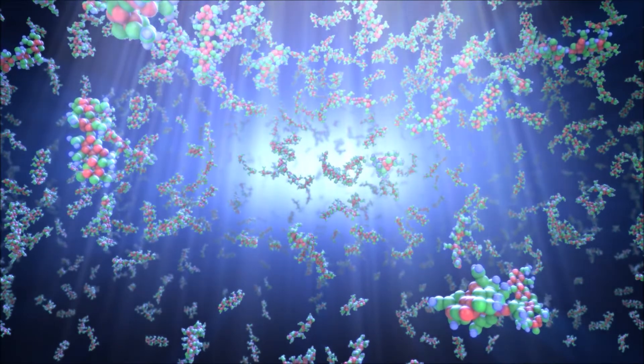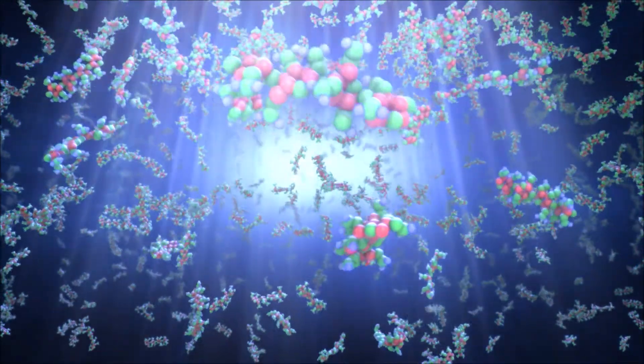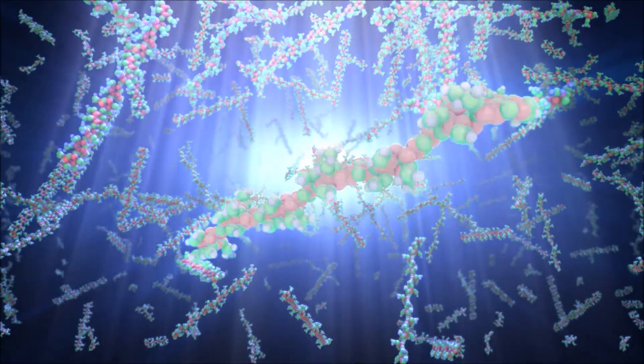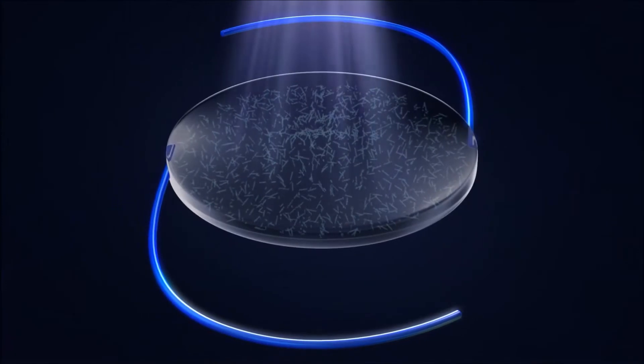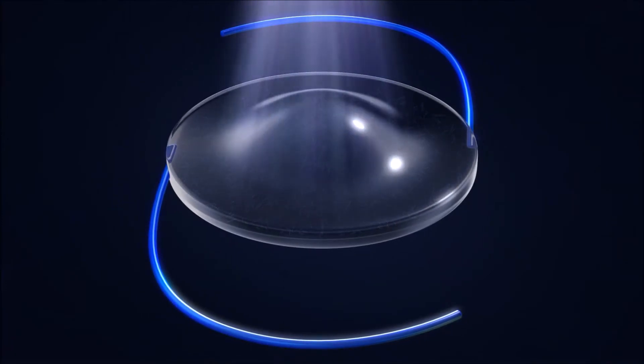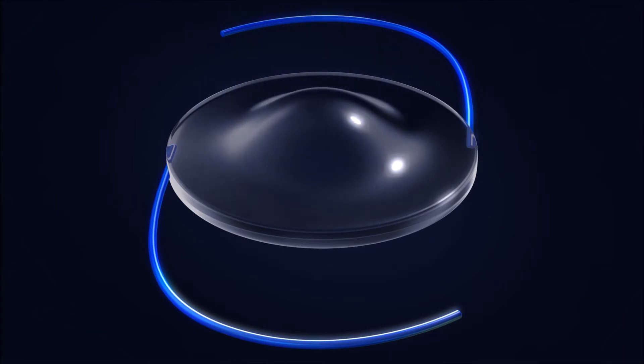When light is directed to a specific area of the lens, macromers in the path of the light attach to the ends of other macromers, forming polymers. The remaining unreacted macromers physically diffuse into the exposed area, causing a highly predictable change in the shape and refractive power of the lens.